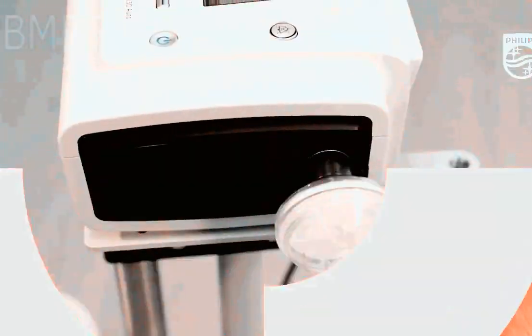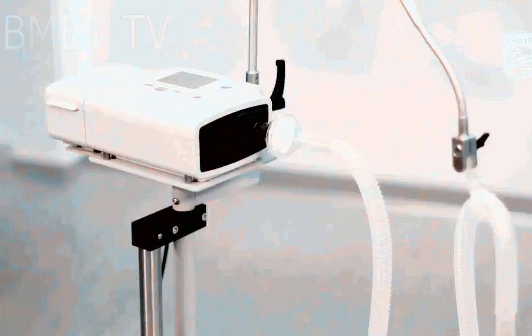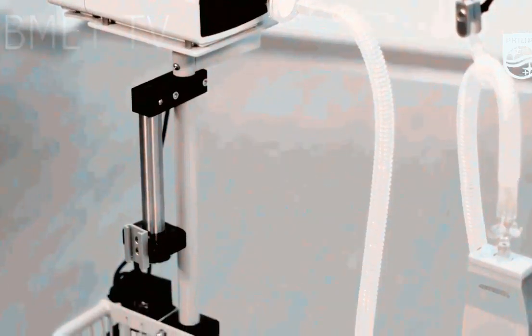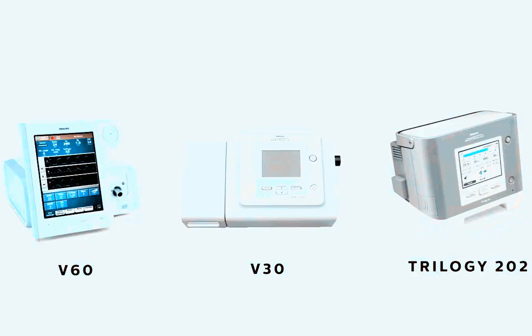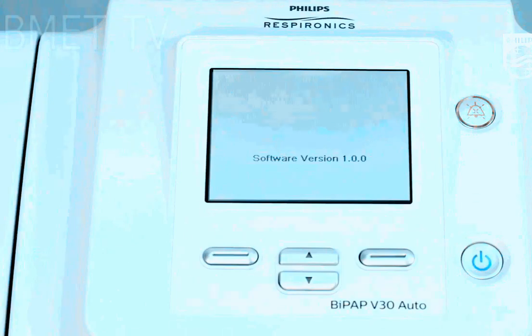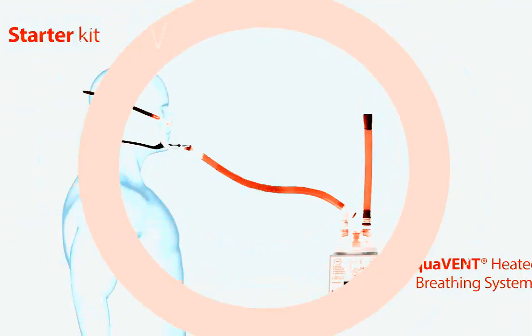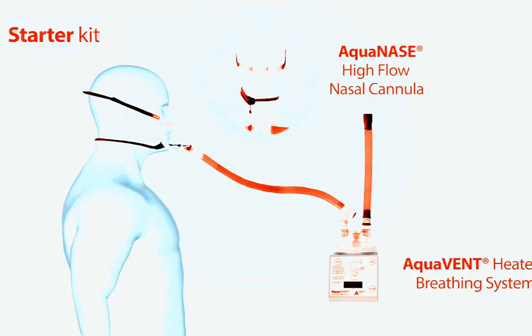The process of choosing a ventilator should be based on a strong scientific rationale, founded on predetermined requisites and scores, as in the critical care area. Because manufacturer specifications alone are of limited importance, they should not be a prominent factor in the decision-making process. Basic knowledge of the principles of ventilator functioning may be helpful when choosing an HCV. This enables the physician or respiratory therapist to consider the HCV's technical performance in relation to the patient's clinical characteristics and underlying disease, the home care environment, and the available financial resources. The primary purpose of this guide is not to compare the individual features of each ventilator, but rather to provide general information about the technical aspects of such ventilators, which may help in the decision-making process.